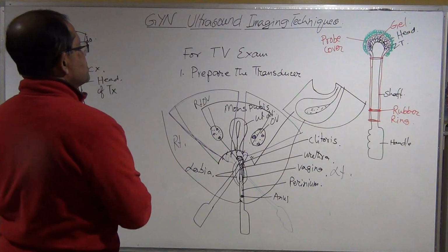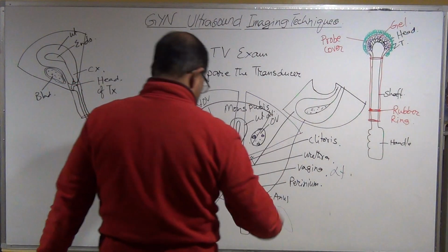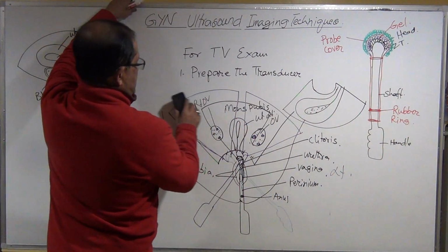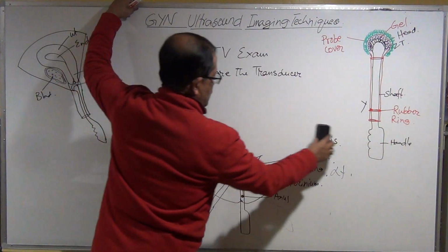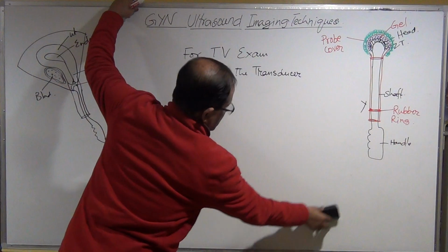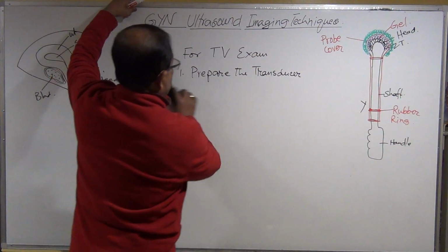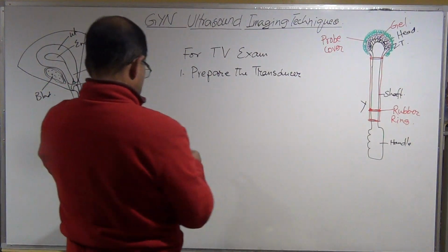Okay, so this is the transverse view. So now let me write down. This is the transvaginal view actually. Prepare the transducer.